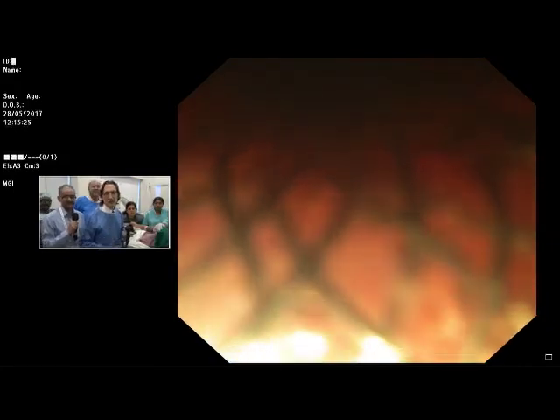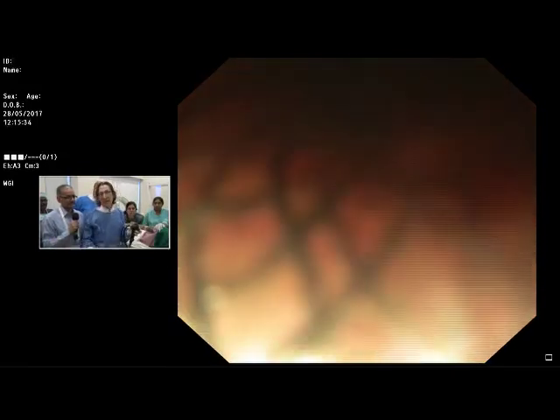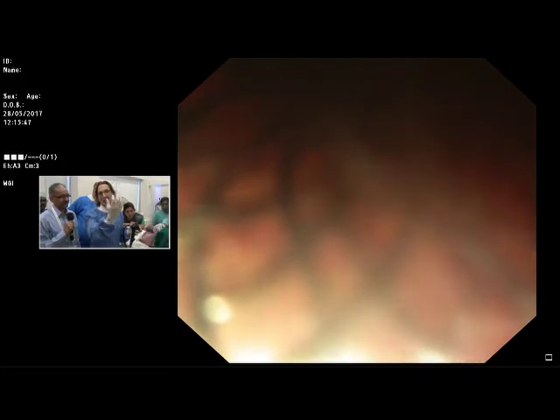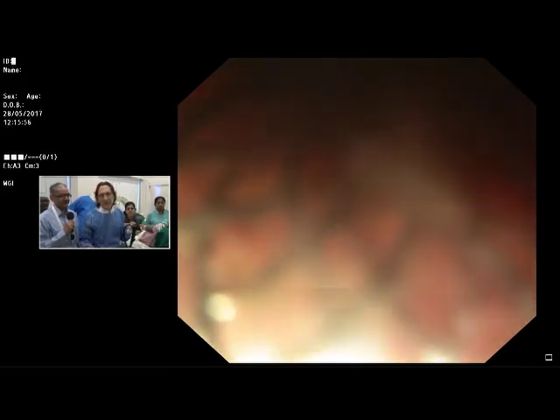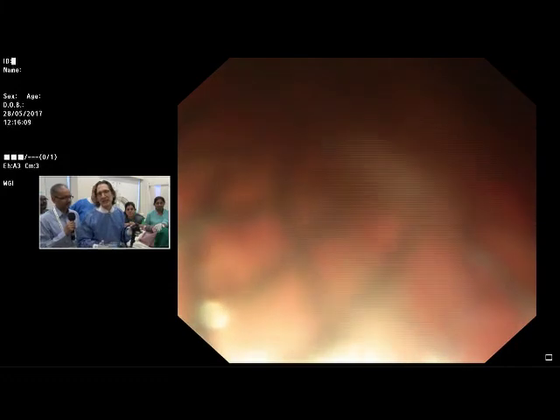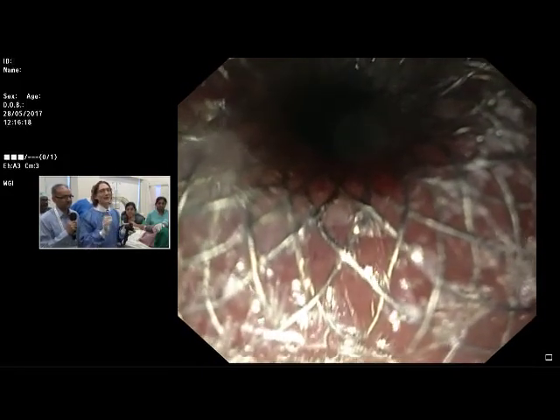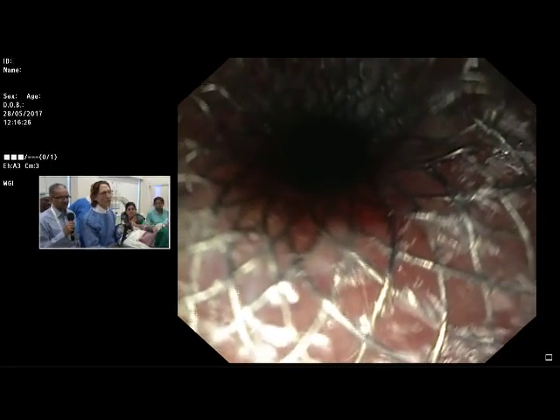When would you remove this stent? The quick answer is this will be gone in two weeks — the patient comes back. You don't get CT or any of that, because that's unnecessary radiation. We want to save the patient from radiation from CT scan. In two weeks the patient comes back, you do EUS, confirm the cyst is gone — or you can look in the stent and see that the back wall of the cyst has collapsed down and started to granulate. Then you just remove the AXIOS with rat-tooth forceps and pull it out, and you're done. In cases where you have necrosis and need to do debridement, bring them back weekly for debridement, and get CT scans at certain intervals. Disconnected duct is only investigated if the patient has recurrence of the cyst after you've removed the stent — then the patient gets an ERCP to look for disconnected duct.